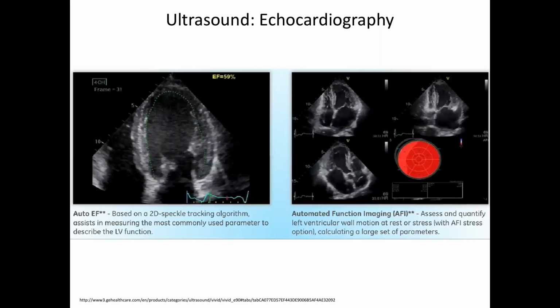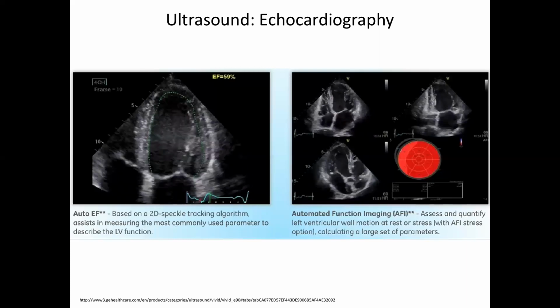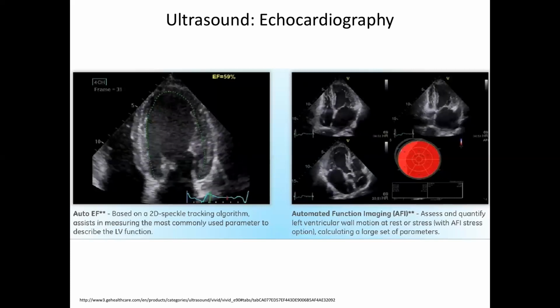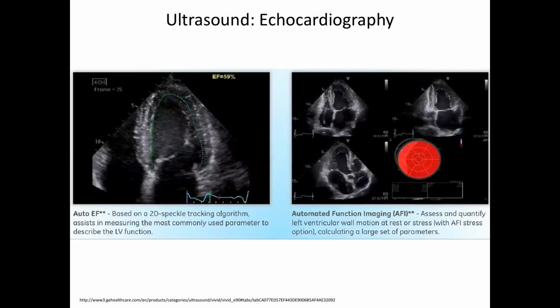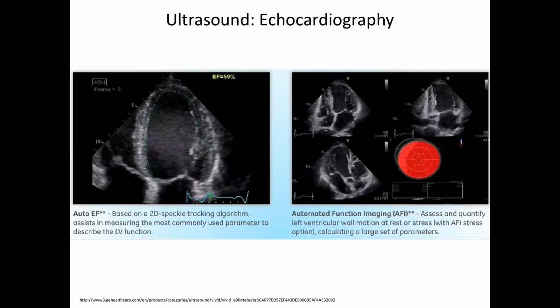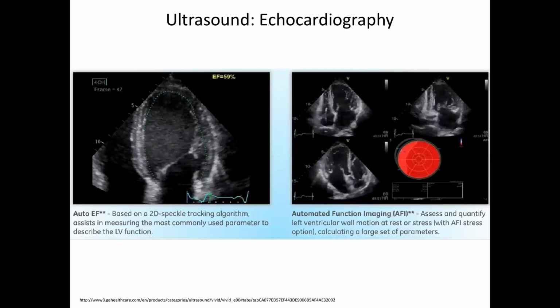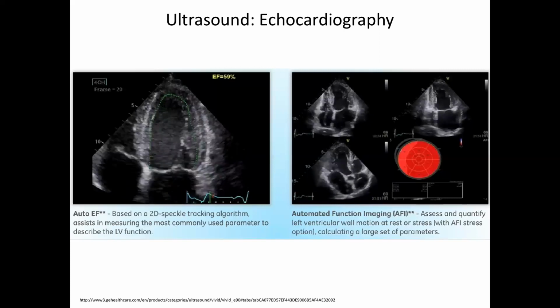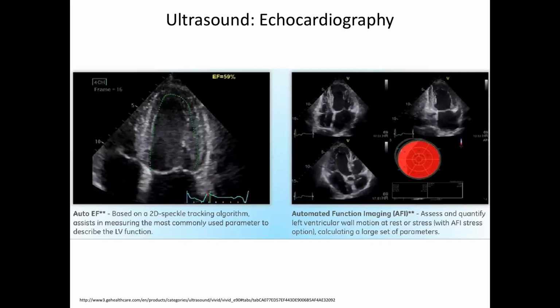It's an expert looking at this going, you know, this heart doesn't look great. This looks like this person needs attention, right? And so a lot of ultrasound is often used as the criteria for applying a certain therapy. And it's usually based on ejection fraction.